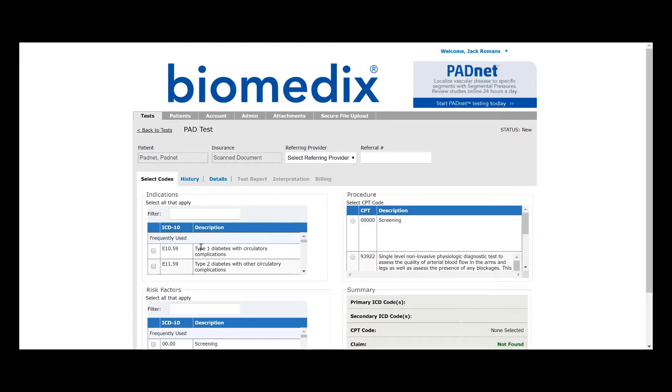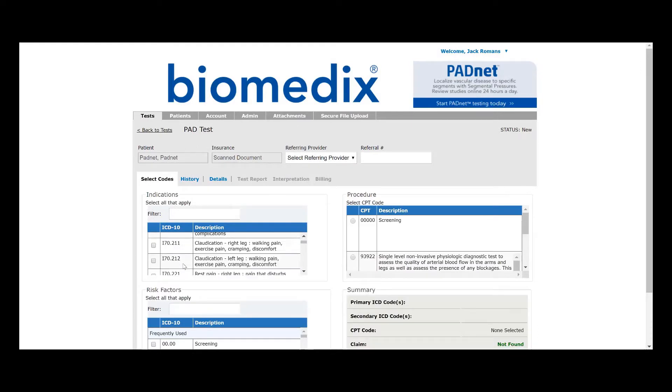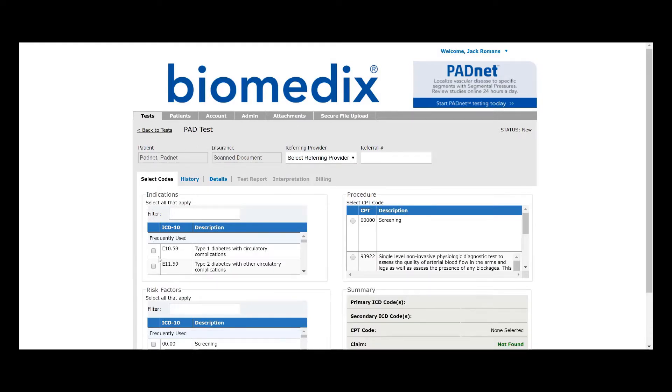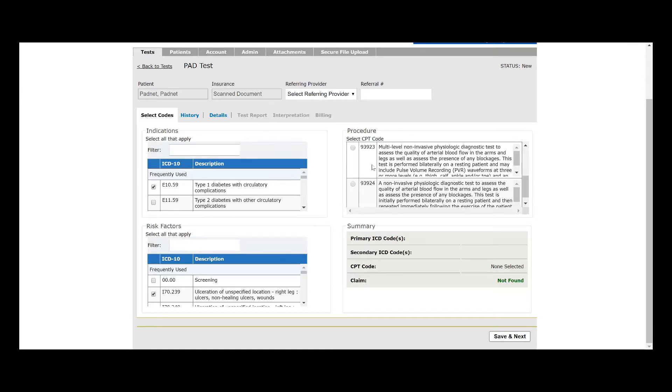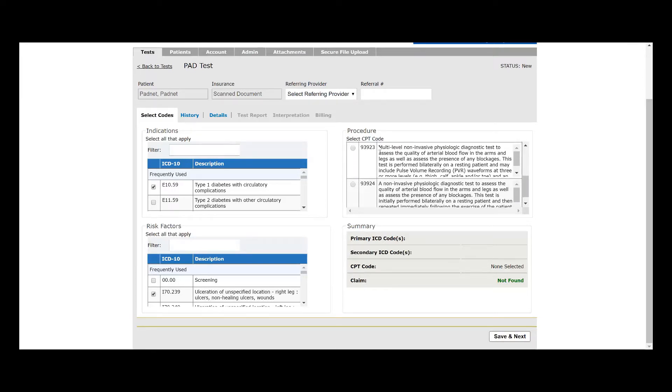This will be the first point of change between the standard arterial study and the provocative functional maneuvering version of the arterial study. Your ICD-10 codes will be entered the same way as before, but our procedure code will be different.